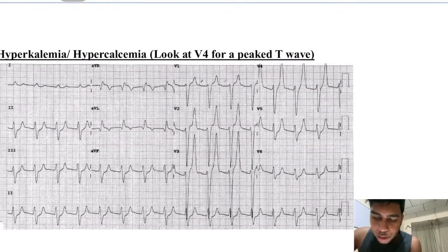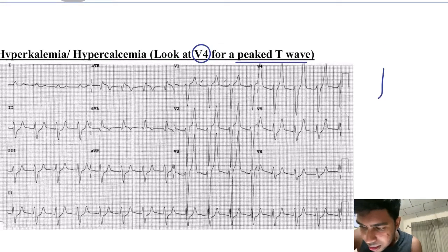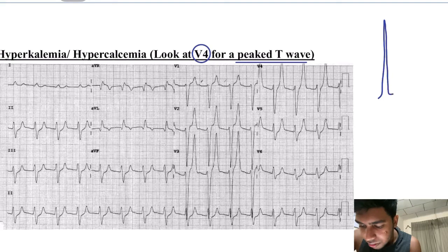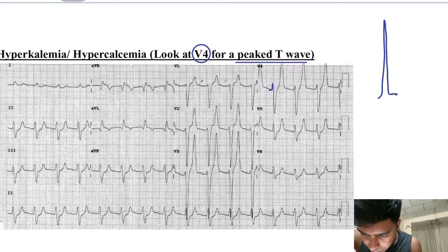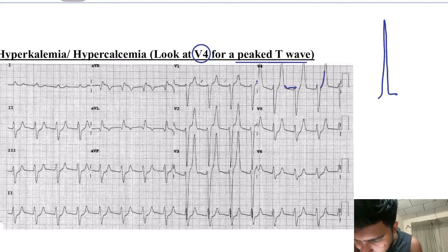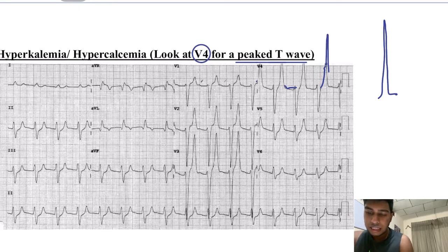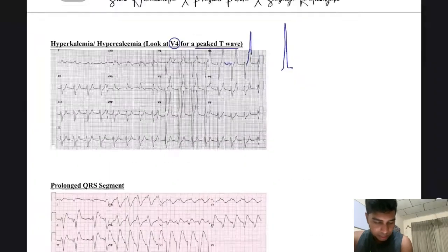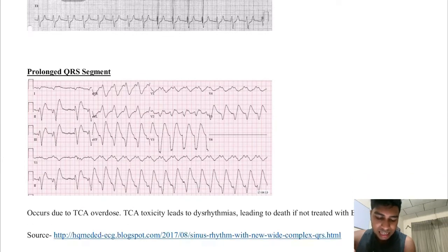In hyperkalemia, look at lead V4 and you will see a peaked T wave — that is just the T wave which is enlarged, you can see it has gone out of the ECG. Look carefully: the R wave ends here and the T wave is going up afterwards. It's just the T wave which is peaked.